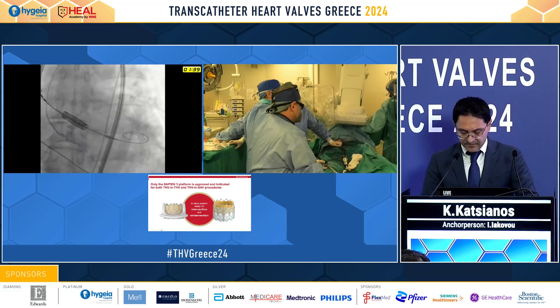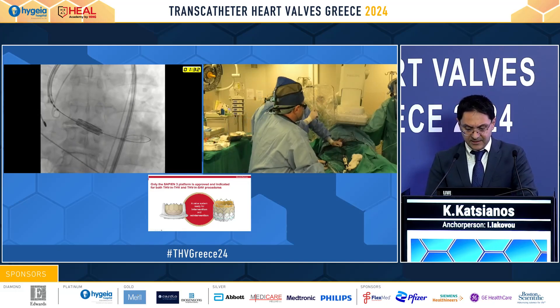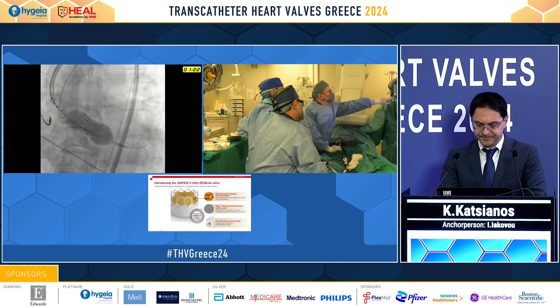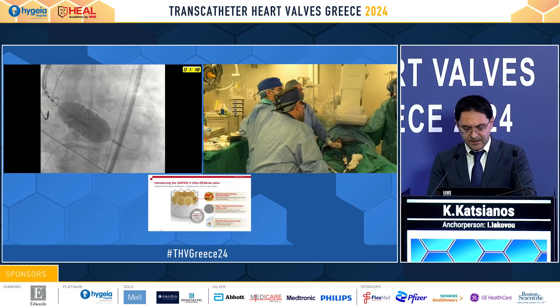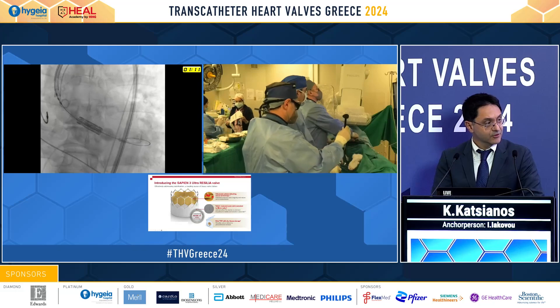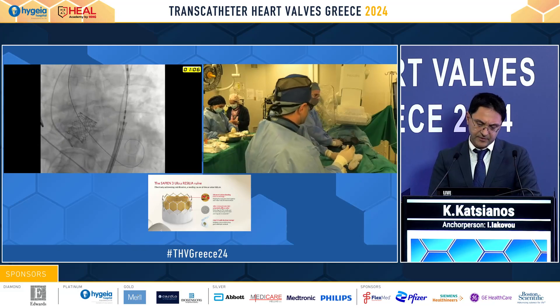We have placed our valve in position, pulled the pigtail, and we are ready for valve implantation. Under rapid pacing, it was a 29mm Edwards Resilia valve, minus 4ml nominal, plus 2 on the balloon. We check the outcome.